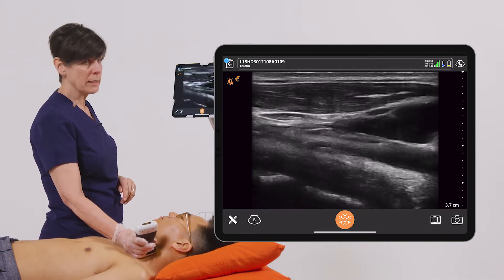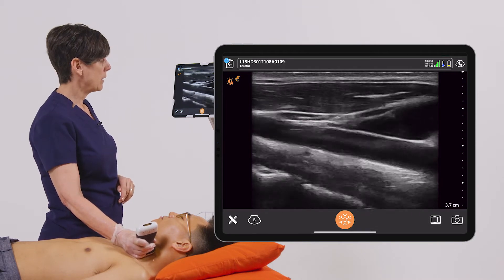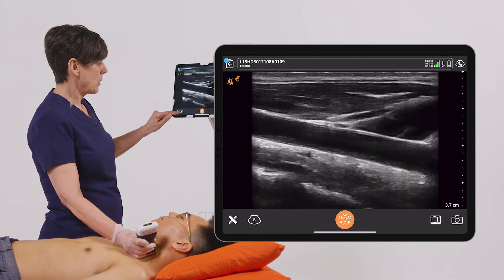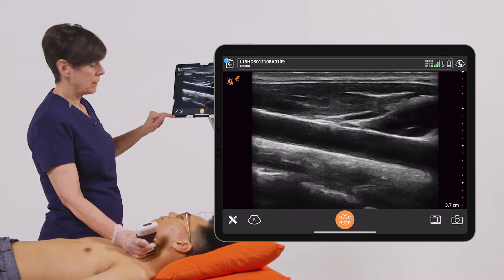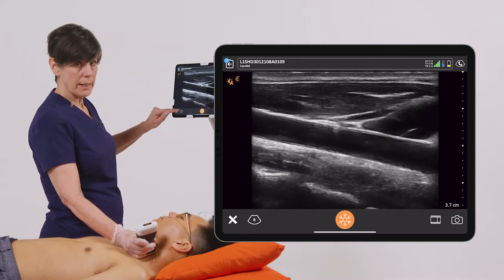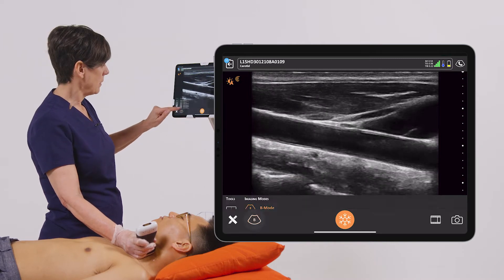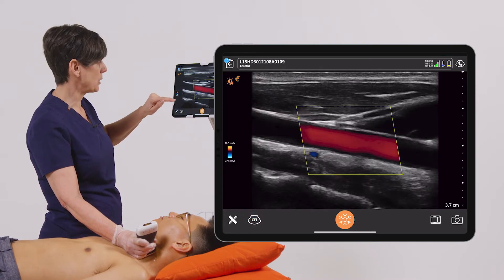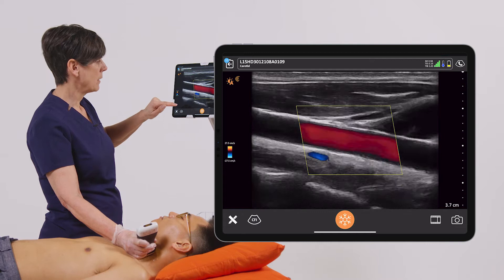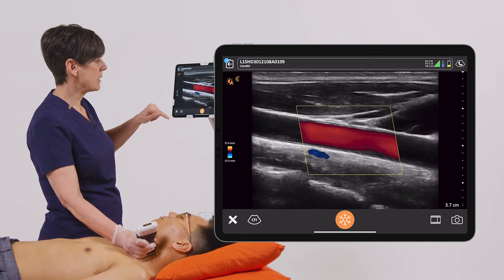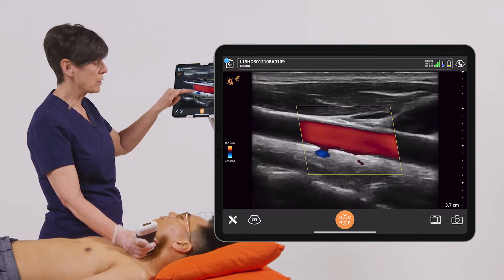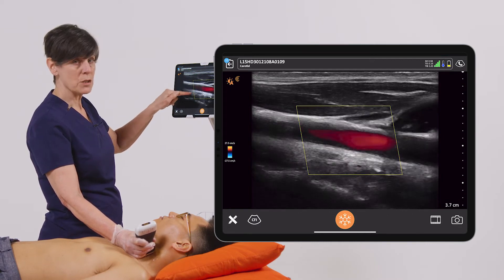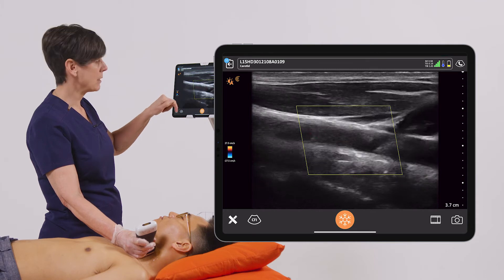I'm going to locate the artery and then I'm going to go down to the mode icon and turn on Color Doppler. And here we see a nice demonstration of carotid artery flow with a smaller venous structure underneath.